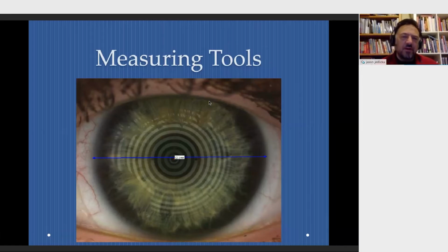So again, this comes into play. We use this in the university setting. We try to be very scientific about our approach to contact lens fitting, and in particular in the area of soft lens fitting, where it can often become somewhat unscientific by simply using disposables and using the same lenses on everybody.